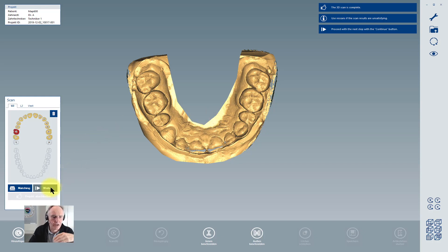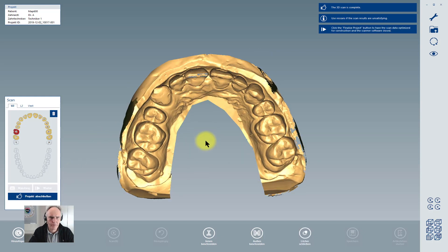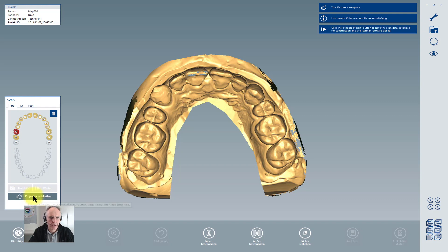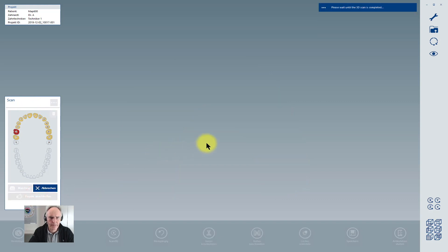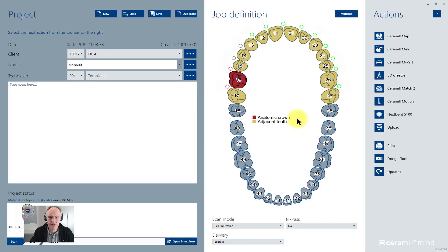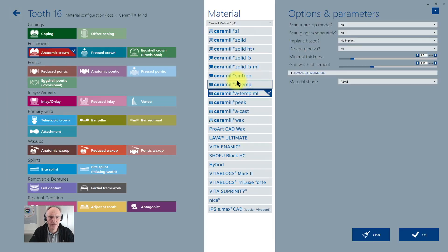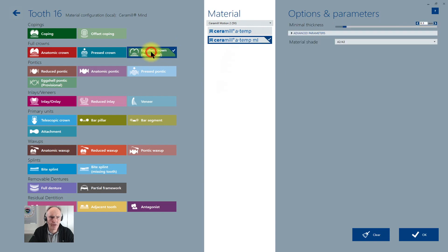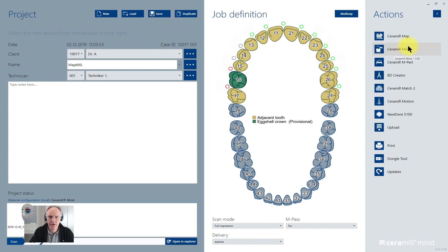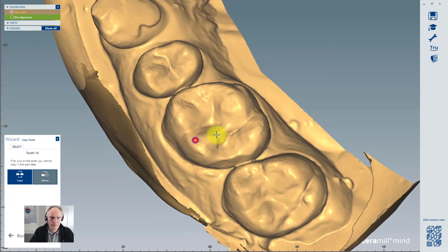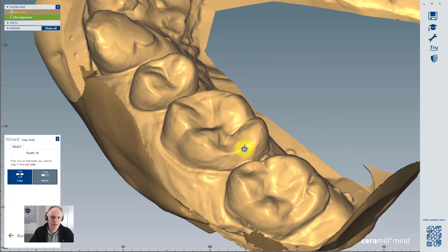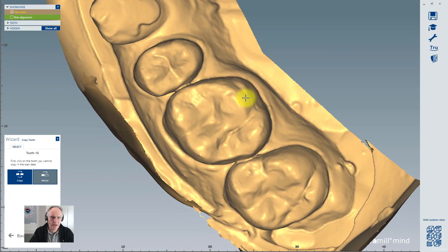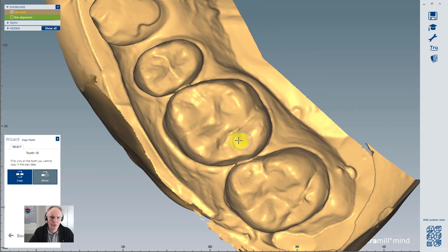After having finished all the scans, upper, lower, and vestibular scan, you can click here the close project button, and you can immediately select here in your indication what kind of work you want to do. For example, here the eggshell crown for provisional in the multi-layer material. Click on save, and then you can start the construction. You can see this is your impression scan, and here on the crown you can directly work without having made a plaster model.